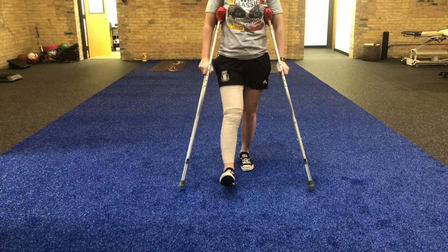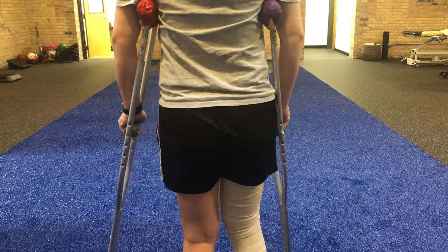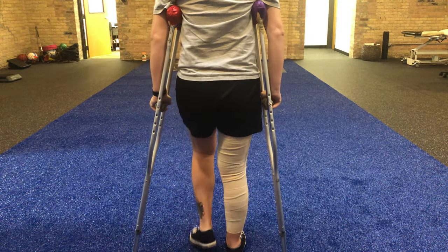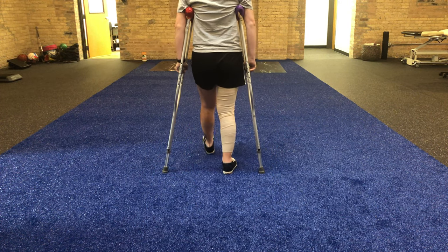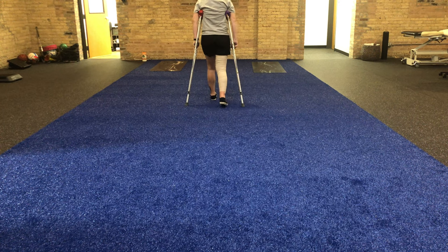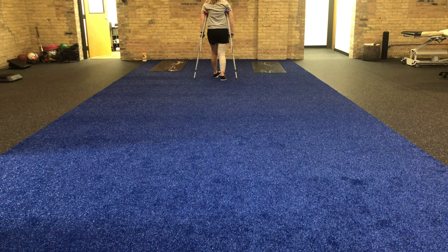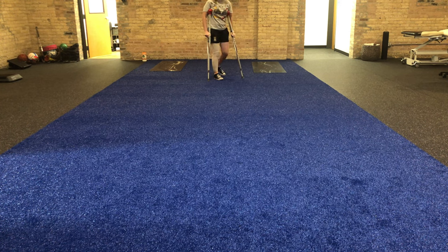You can see that we got a little bit more range of motion during her walking, and we'll do it one more time. The crutches go with the surgical leg and take the weight off of that surgical leg. Good, keep that knee range of motion, bend backwards, heel strike, good.